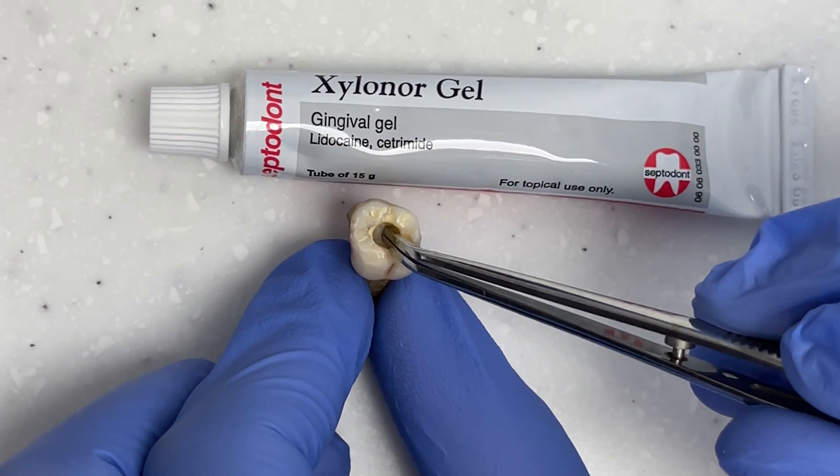The topical anaesthetic has a very high concentration of LA and that should help the bleeding. This is also helpful when the patient can sometimes feel pain, because the coronal pulp chamber in those scenarios is the most inflamed and most difficult to get numbed up.